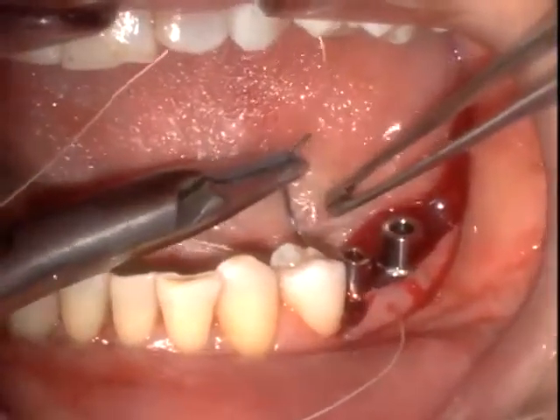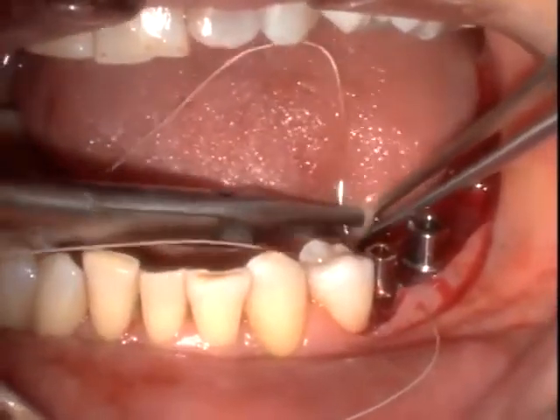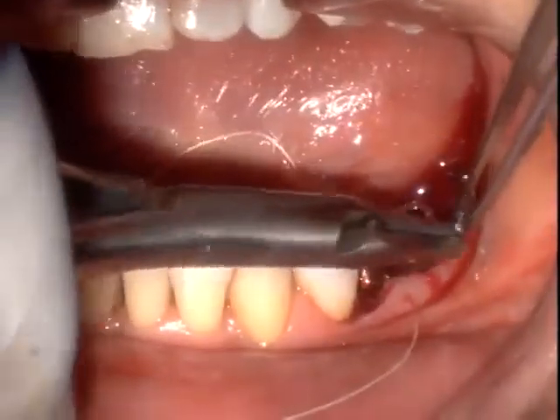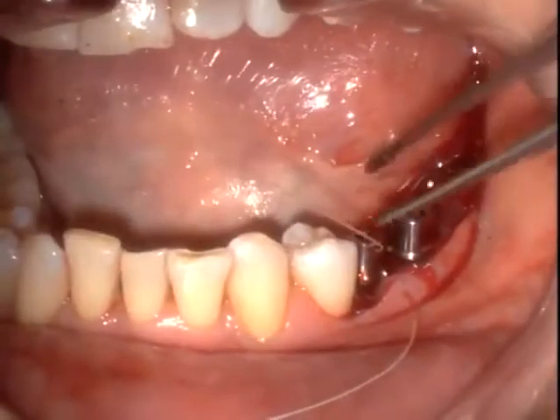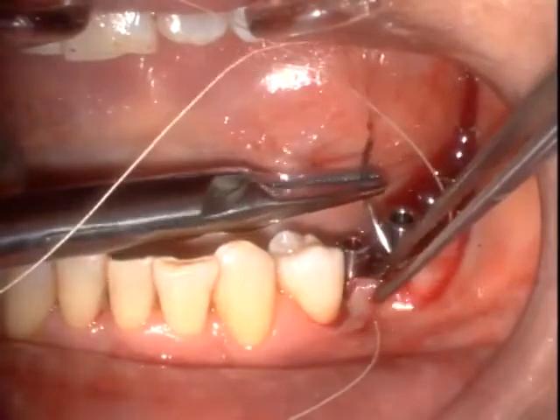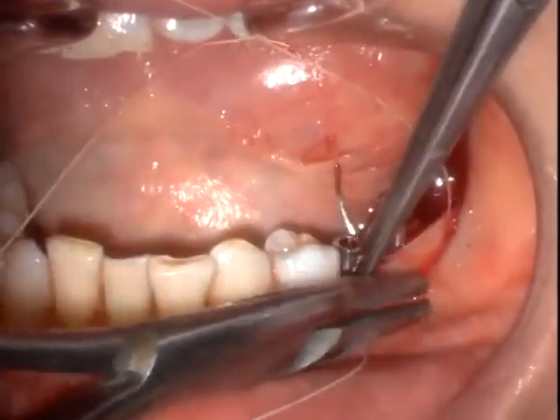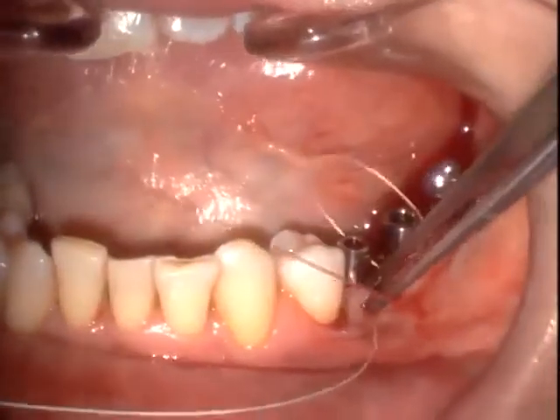This is a resorbable autologous material with growth factors, something I've learned from Dr. Eduardo Anitua. Plasma rich in growth factors, and fibrin is something that I've utilized quite routinely in my clinical practice and has been highlighted over and over again on my clinical videos on Dental XP.